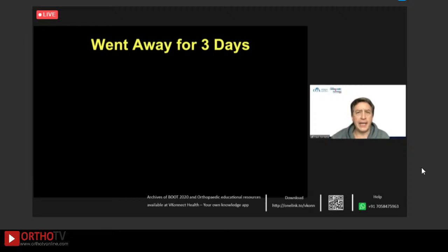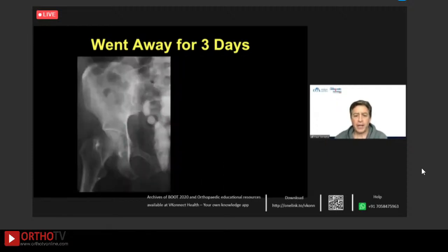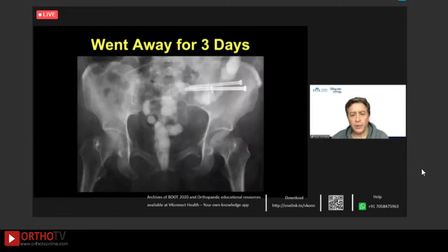So I went away for 3 days to a meeting, and I came back. I said, all right, well, let's just get a portable and be able to plan, because probably in a couple of days we'll be able to bring the patient back. And, you know, this side looked the same, but this side didn't look quite the way it used to. So obviously this was a fairly dramatic early failure.